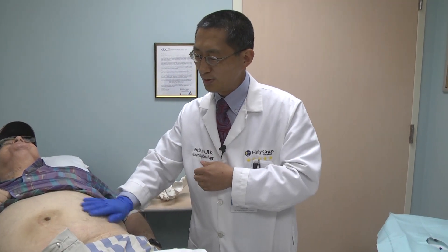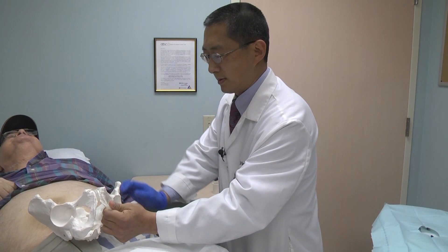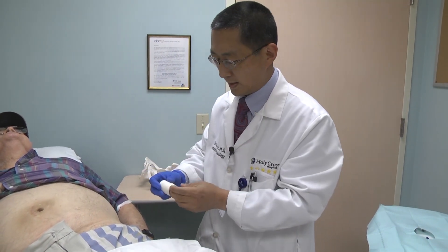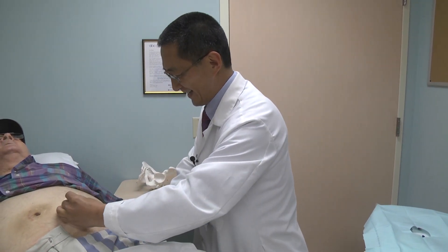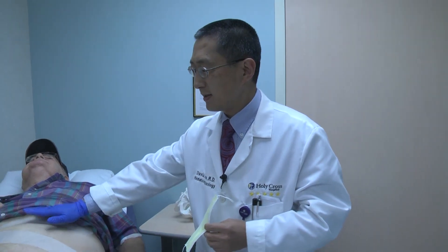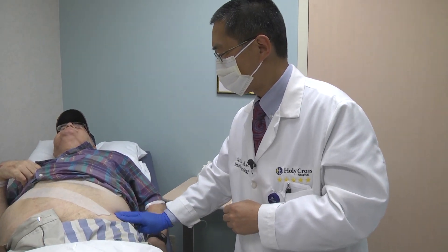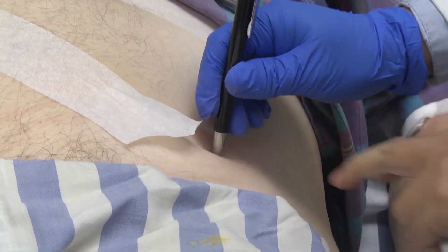For him, I will of course start by palpating. You can already get a feeling over here, this area going to here. Sometimes I will have to use an instant tummy tug for heavier patients — I use a wide tape to move the fat layer to expose this area for better touch. After palpating this area, I usually use a pen to put a mark right on the bone.